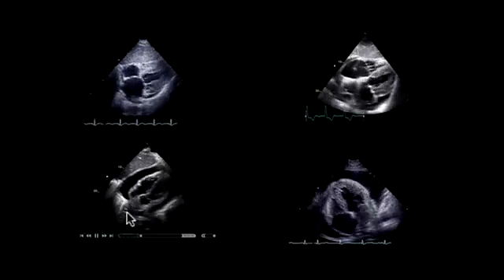These were some examples of the short axis view, but probably the best view to examine the pericardial effusion is the subcostal view, the subcostal four-chamber view. And here are a few examples. Very small pericardial effusion, a bit larger, even larger. This I would already consider a large pericardial effusion, and this is a very large pericardial effusion.